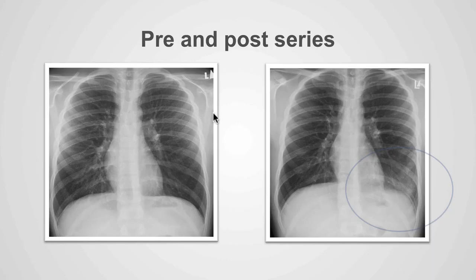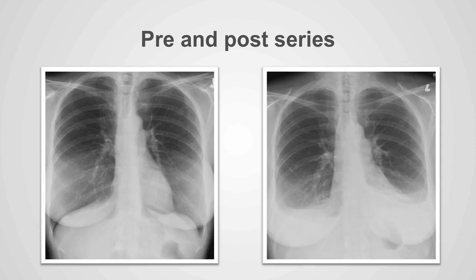Now let's do some example cases. These are two x-rays of the same patient. On the abnormal x-ray, we can identify that within the left side inferiorly there is an increased density — it's too white when compared to the normal x-ray. The reason for this is because the patient has a left-sided pneumonia. On another pair of x-rays, we see whiteness inferiorly on both the right and left sides, which was not present on the previous examination. The patient has developed bilateral pleural effusions.